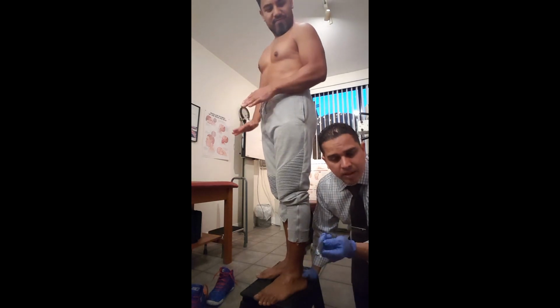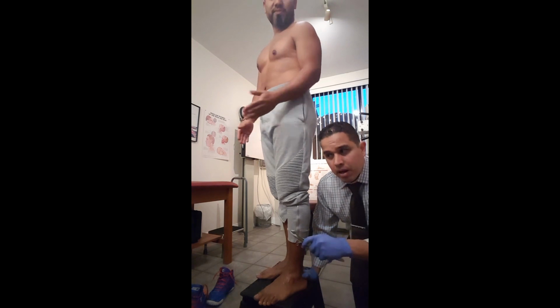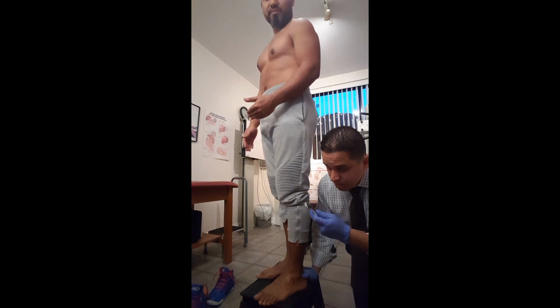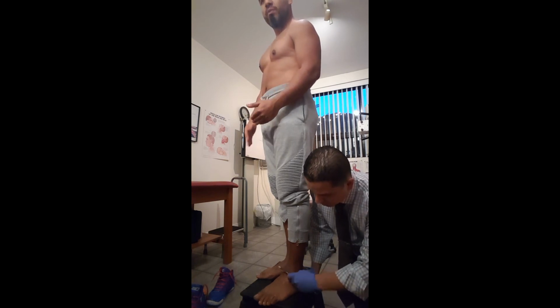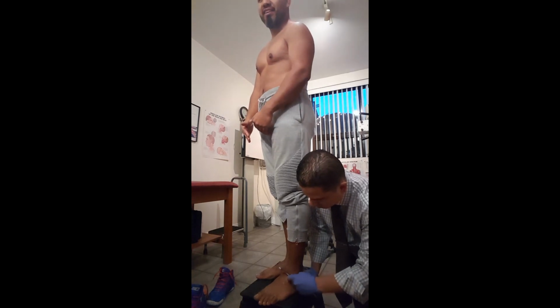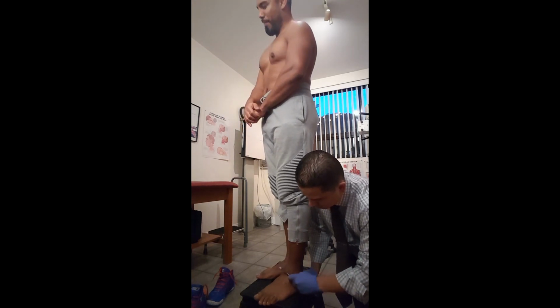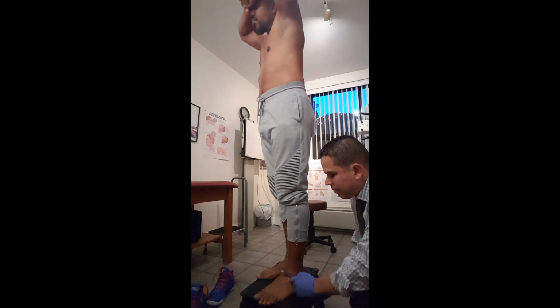See, he can't even tell me right now. I'm passing this metal right through that ligament, and it's like the last few times, and you're not feeling really anything here. Correct. Oh, it's somewhere around there. Okay. All right. So we're gonna go through it, and we'll see if there's anything right there. Right there. Yeah, right there.